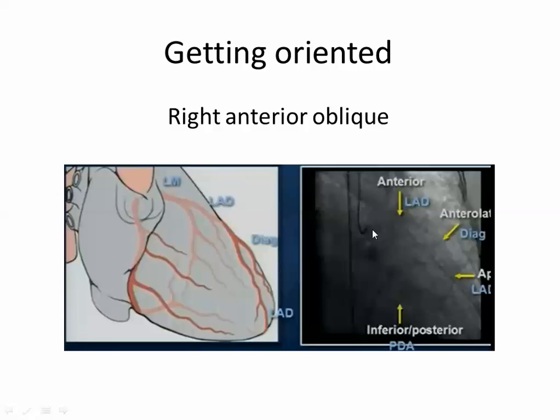If you want the RCA, where do you expect the RCA here? It will be on the same level. This is the atrioventricular groove, but it will go backward and appear here. With the LCX, yes, but from behind. Okay? We will get the left system alone, then the right system alone, and then both simultaneously. Okay?